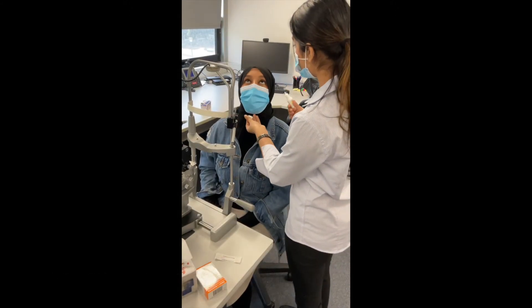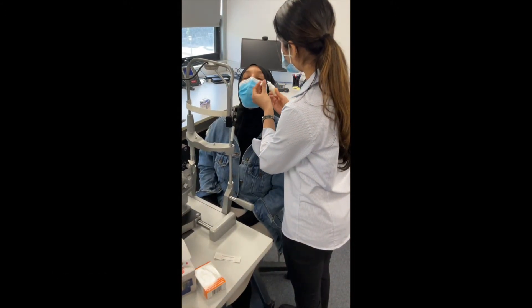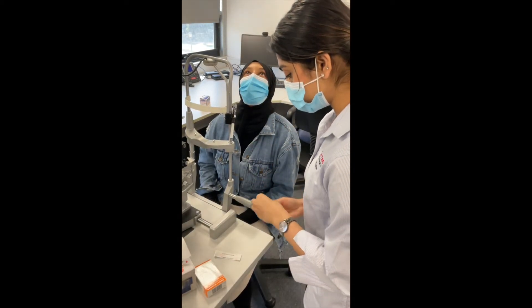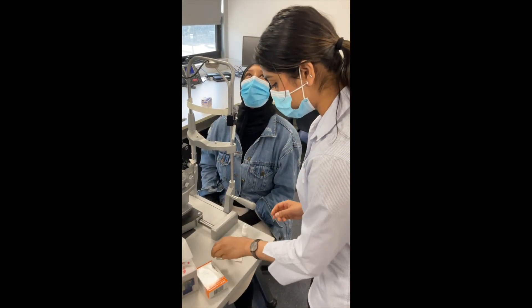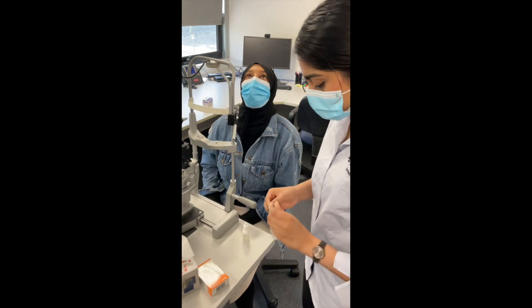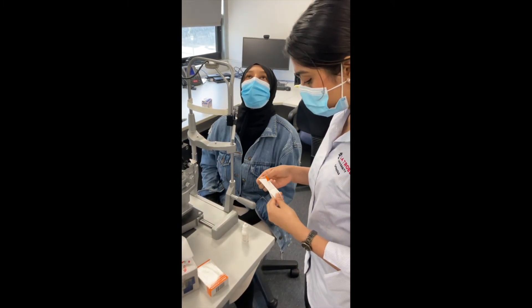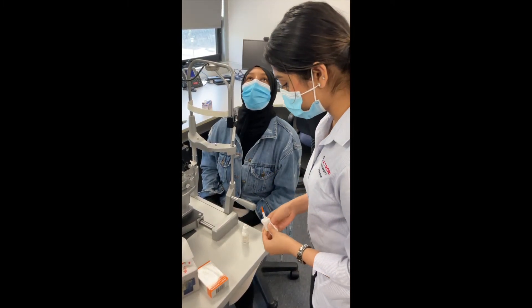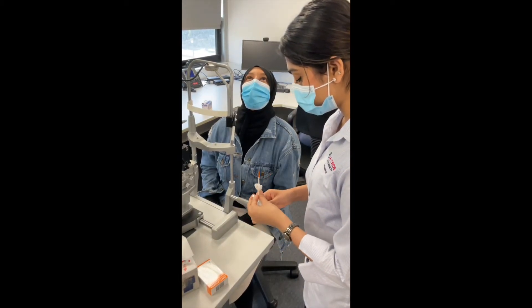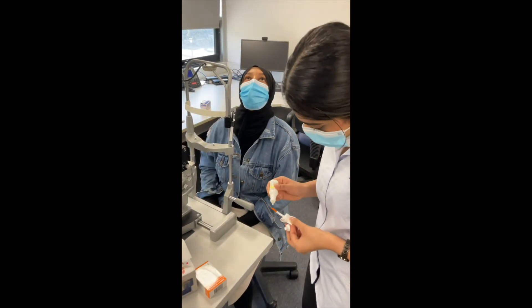When applying the local anesthetic and fluorescein, ensure the expiry date is valid and that the patient isn't allergic to the agent. Ask the patient to tilt back, gently lower the lower lid, and apply the local anesthetic and fluorescein. Avoid using too much fluorescein as it can impact the results.